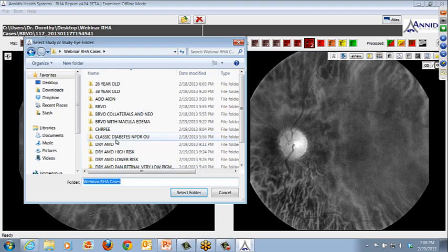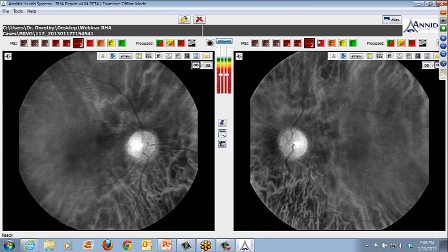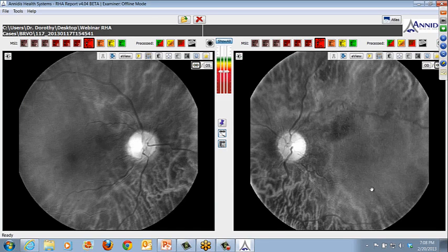Sure. On this case that you're looking at right now on that left side, how would you recommend that a doctor make that distinction whether or not that is elevated or not? Right here? Yes. I would actually compare my imaging to my ophthalmic view, because you're going to look at these patients, right? You should be looking at them with the 78 or a 60 wide field lens, and looking at their retina to look for other clues of elevation.